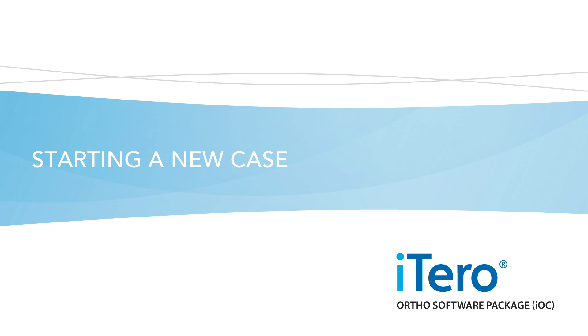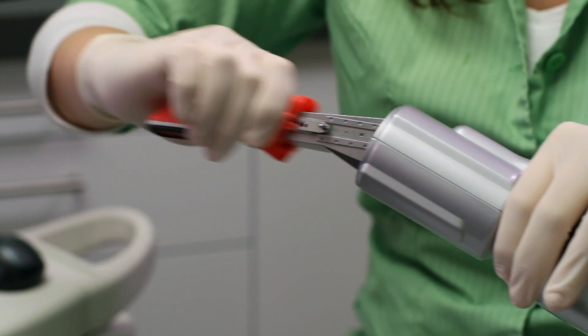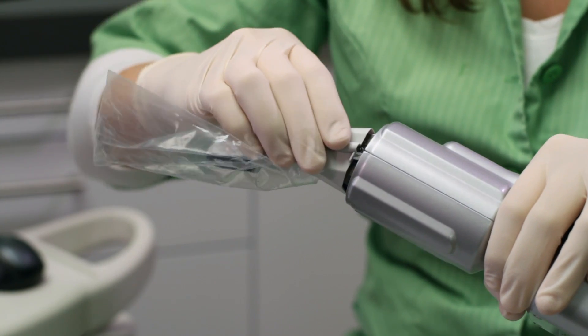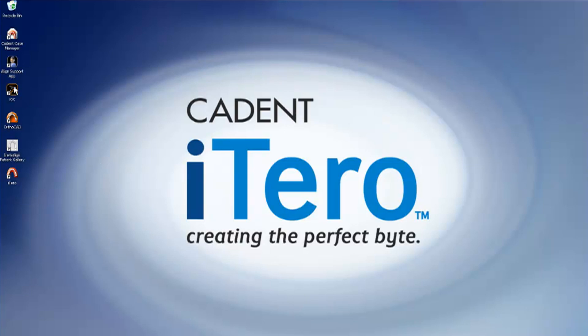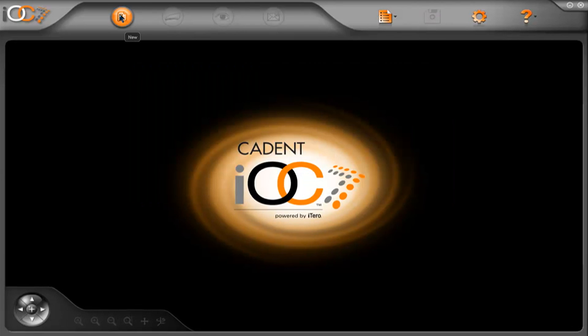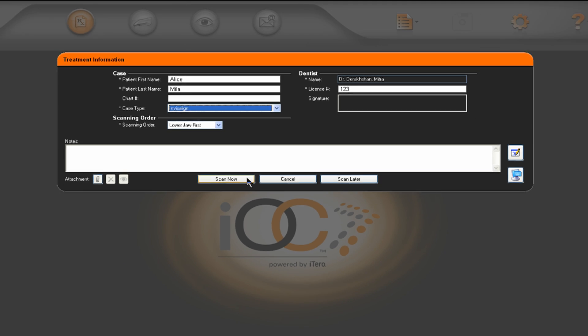Starting a new case. To begin a case, first remove the cover sleeve on the iTero scanner. Press on both sides of the sleeve to release the cover. Attach a brand new, single-use disposable sleeve, making sure that the sliding cover lines up with the sleeve so that it snaps into place. Now double-click on the IOC icon to open the scanning software. To start a new patient, click on the RX button, fill in patient details, select the case type, and press Scan now.